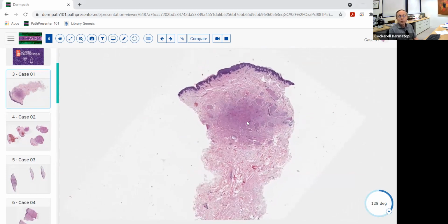So muscle, there's really obviously two types of muscle. There's skeletal muscle and there's smooth muscle. In dermatopathology, we almost never see skeletal muscle lesions. They're almost always smooth muscle. And there's really two main ones that we have to think about. There's the pilar leiomyoma or the erectile tissue leiomyoma, which both look pretty much the same, the latter often from areas like the nipple, the scrotal area, the labial area. And then angioleiomyoma, which comes from blood vessels, probably the wall of the blood vessels, and forms a nodular lesion. I'll show you one of those in a second.